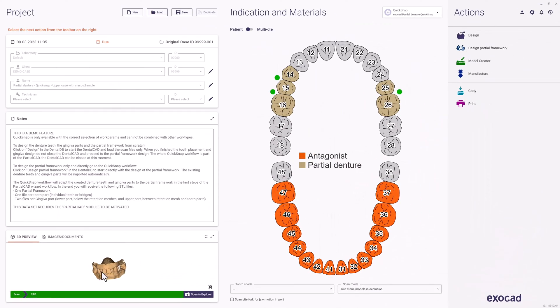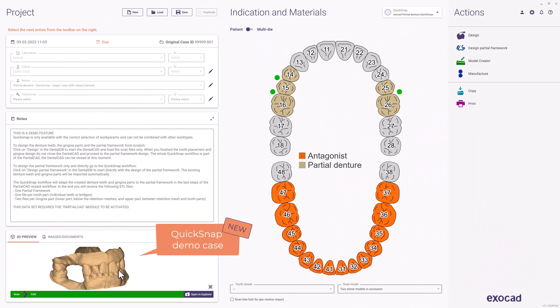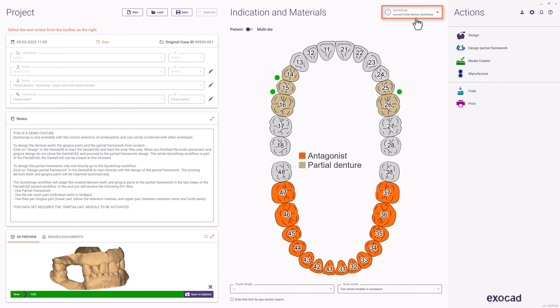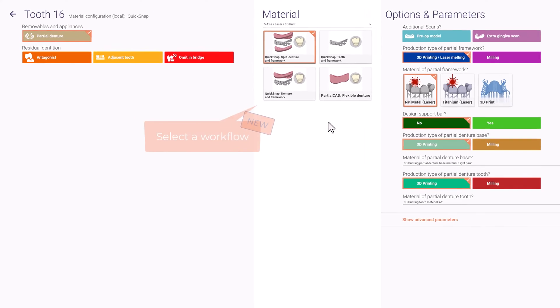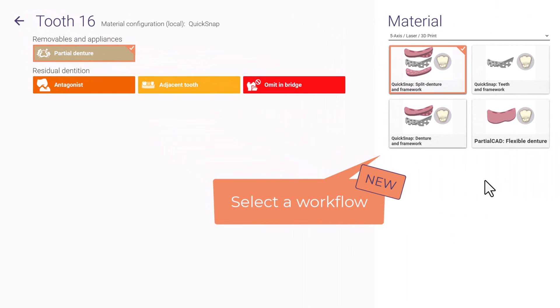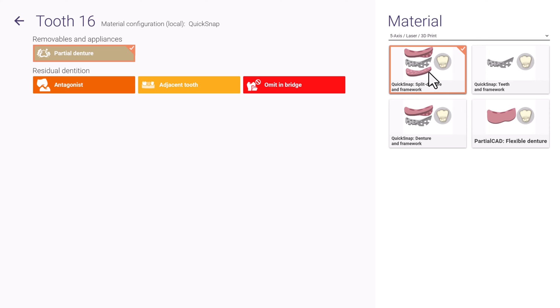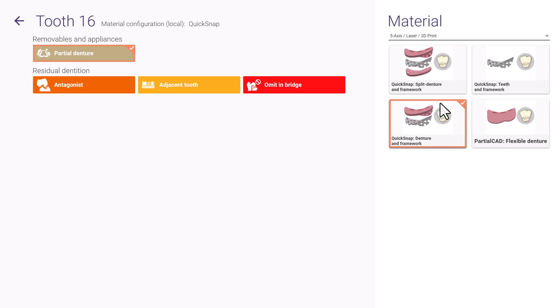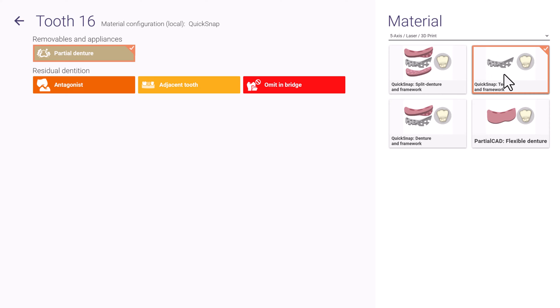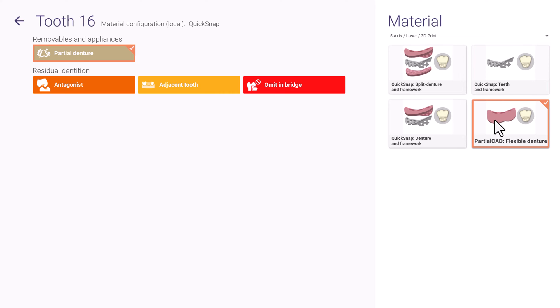We prepared a new Quick Snap demo case and provided a material configuration necessary for this workflow. In the material selection, four different types of workflows are available: the normal Quick Snap way creates two different parts of gingiva separated into a bottom and top layer around the framework. Alternatively you can get only the top part of the gingiva, or no gingiva at all. A flexible denture workflow is also available.